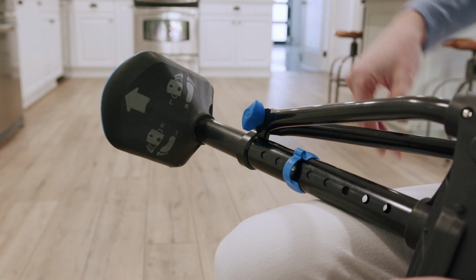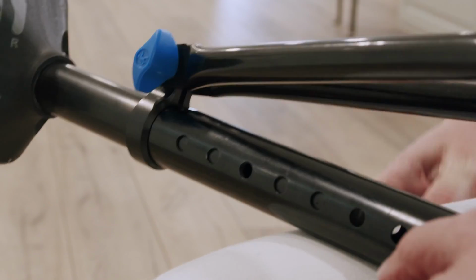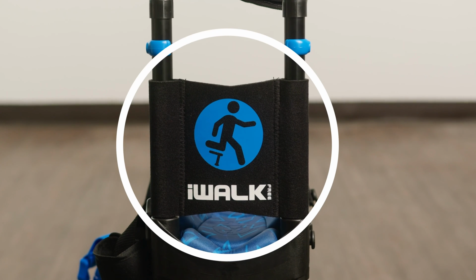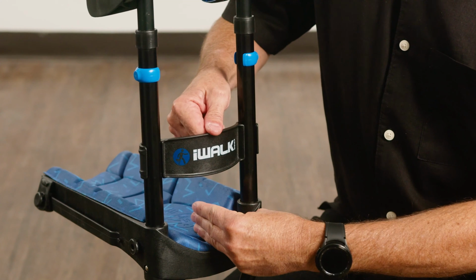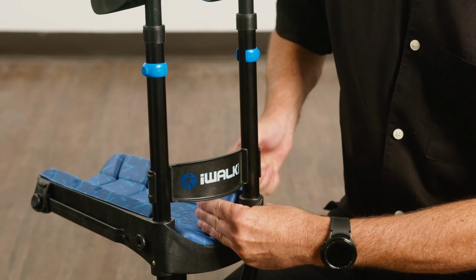To reorient the foot, remove the height adjustment C-clip. Rotate the foot 180 degrees, then reinsert the C-clip. Gait strap adjustment. If your iWALK crutch has the fabric gait strap, no adjustments are necessary. If your crutch came with the plastic gait strap, position the strap approximately 3 finger widths above the top of the knee platform. It can be repositioned later to optimize for the patient.